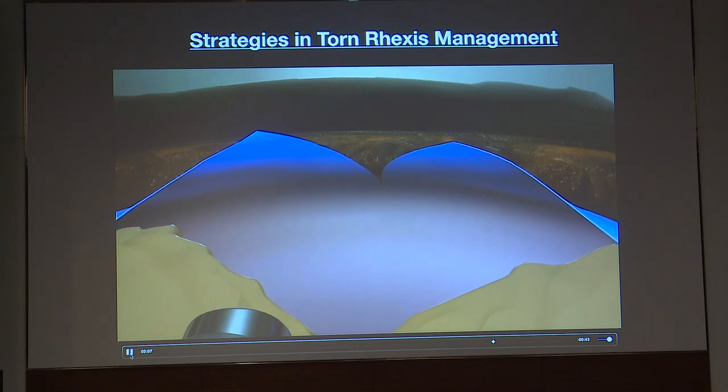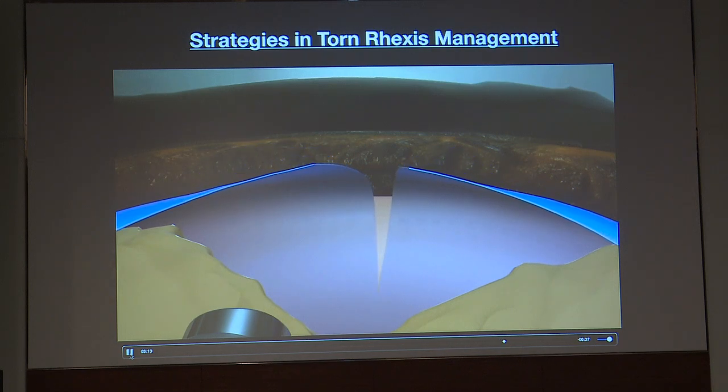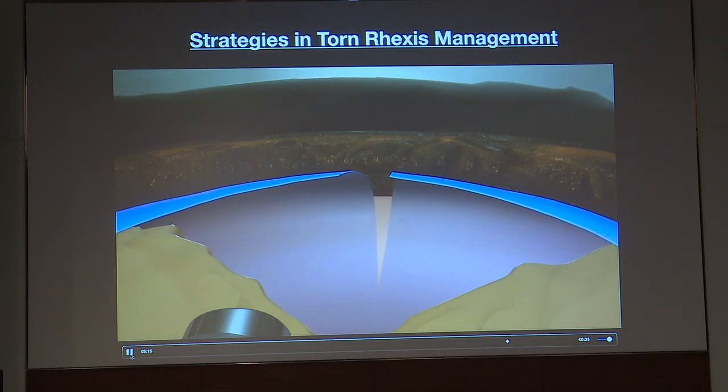But once the pre-equatorial flap extends beyond the equator, the flap becomes inverted and stops fluttering. As there is a breach in the barrier in the event of posterior extension of the extended anterior capsular tear, there is pulling down of the anterior capsule tear.